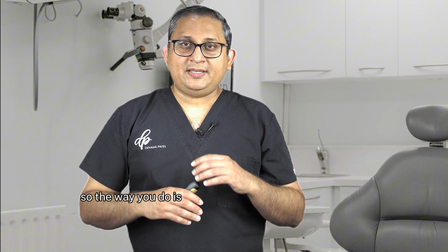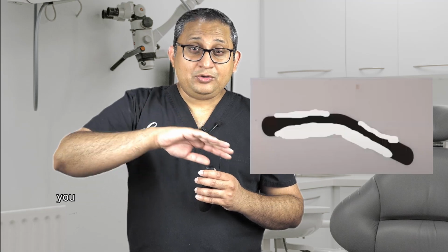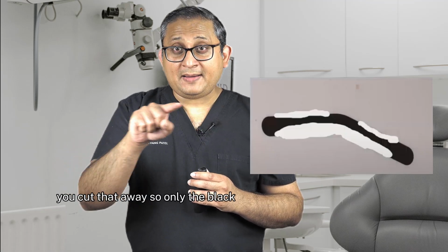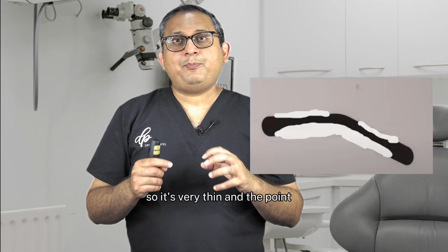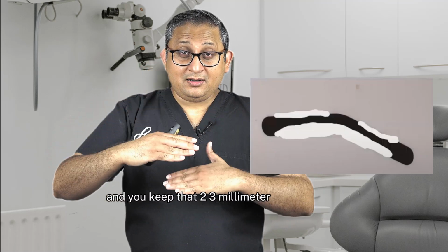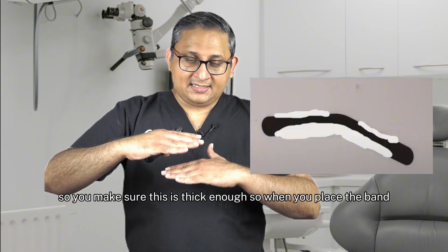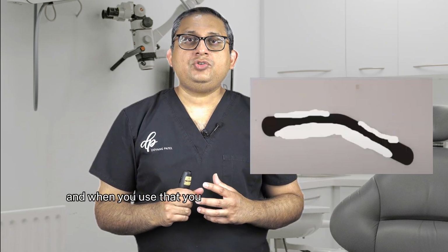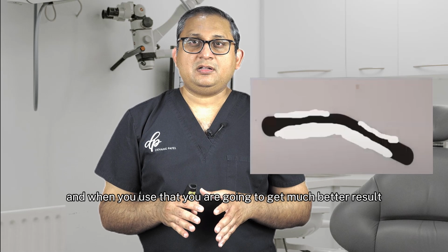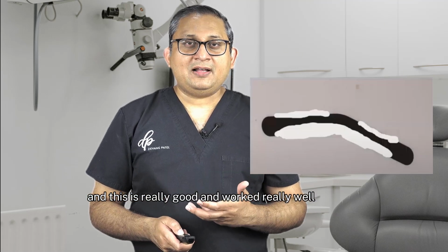So the way you do it is you use the scissors, and wherever the white area is on the photo, you cut that away. So only the black area or the gray band is visible. So it's very thin, and you keep that 2-3 millimeter supragingival. So you make sure this is thick enough, so when you place the band, it's 2-3 millimeter supragingival. And when you use that, you are going to get a much better result, and you will be able to push the band subgingivally. And this is really good, and it worked really well.